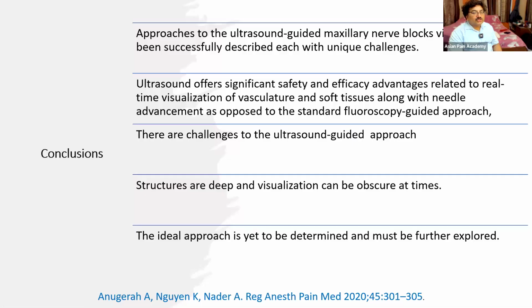Okay, so in all those they have concluded that the approaches to the ultrasound guided maxillary nerve block via the pterygopalatine fossa have been successfully described, but not without its unique challenges. Ultrasound offers significant safety and efficacy advantages related to the real-time visualization of the vasculature and soft tissue along with the needle advancement, as opposed to the standard fluoroscopic guided approach.